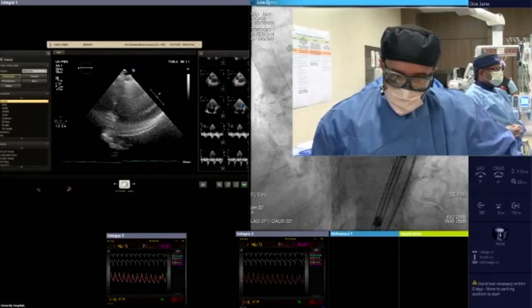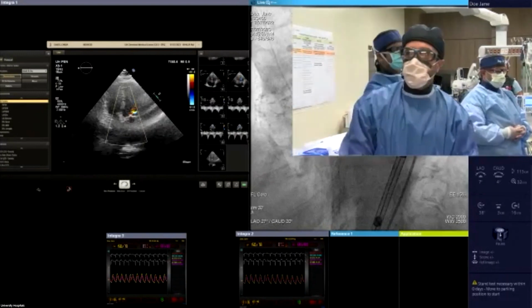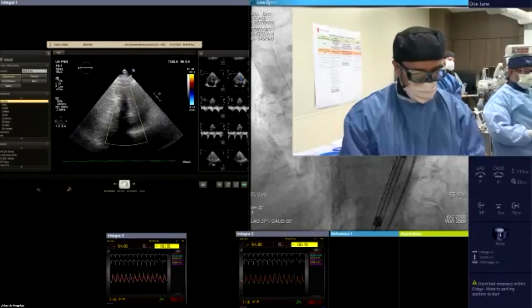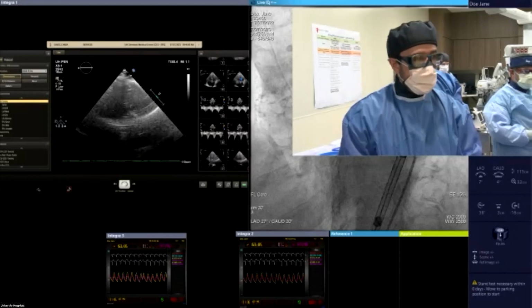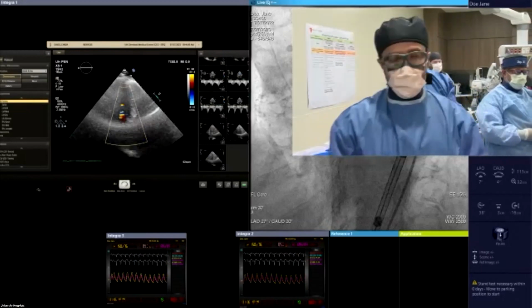It's well crimped, etc. You mean a final aortogram? That's what you're talking about? No, before implantation. No, I think they did do that probably off screen. He was saying after the valve is crimped on the catheter, do you X-ray to ensure that it's not a misload? Yeah. Oh, we did that. We did that. Yes, we did that.